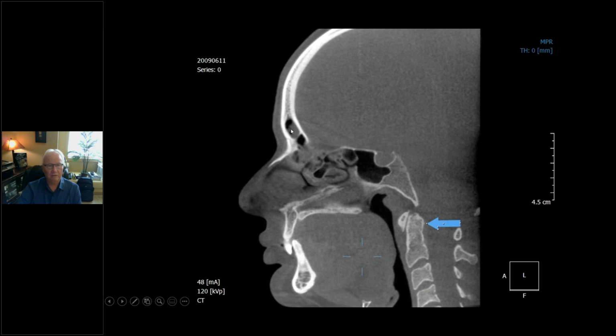But here's the change in the frontal sinus. Here's the change in the ethmoid sinus. Here's an opening into the sphenoid sinus. That change can go there as well. So this poor kid may end up with a pansinusitis, and what you were treating him for was to move his teeth around orthodontically. So if you have the volume, you need to look at the data.